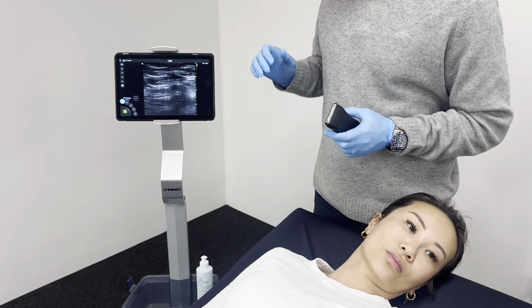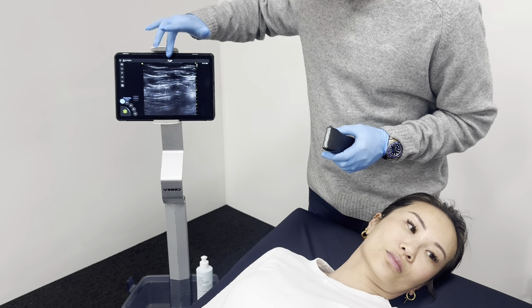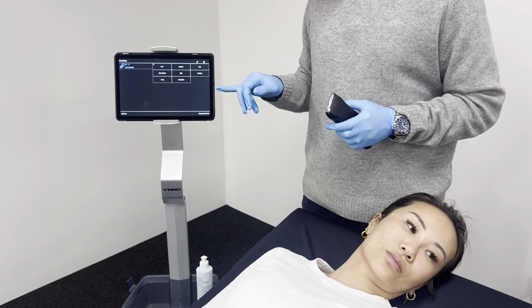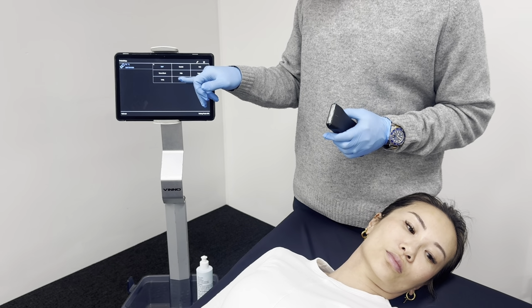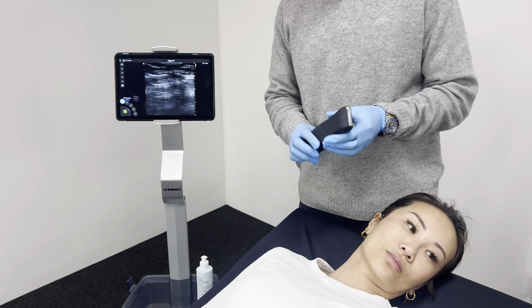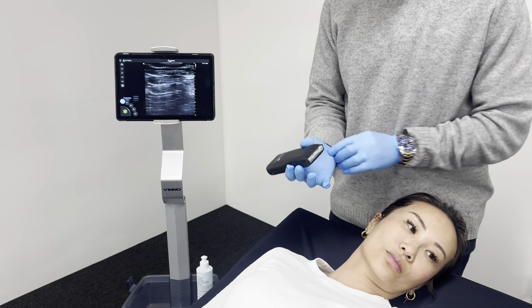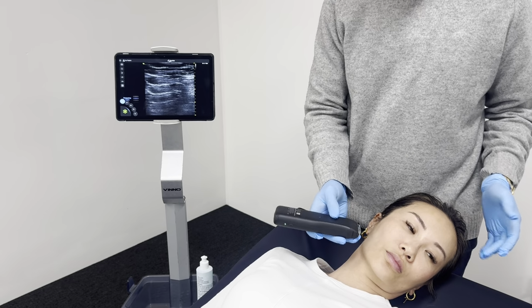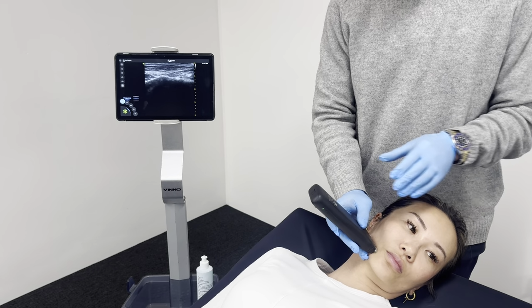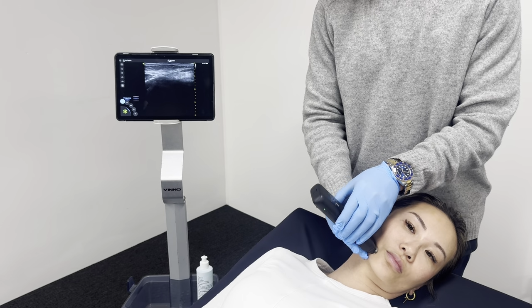Once you have your probe connected, you can select a preset, so you can come up the top here. If you don't have a static preset already created, I would suggest starting with the musculoskeletal preset. Then what we're going to do is begin by placing the transducer on the lower face. So we'll start just in line with the mandible down here, and we're going to make some adjustments to the image to make it a little bit clearer, a little bit easier for us to see.